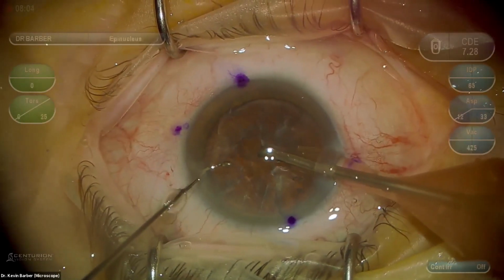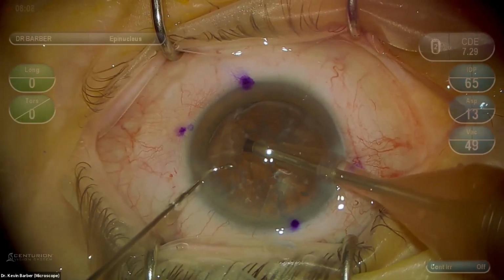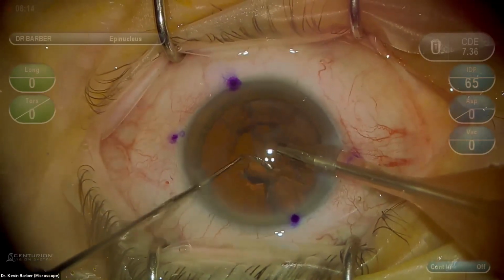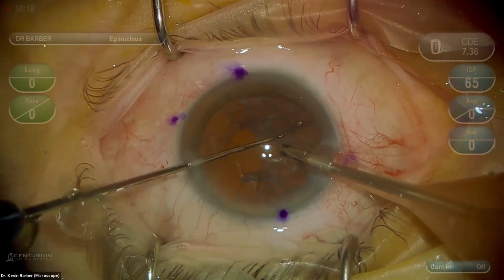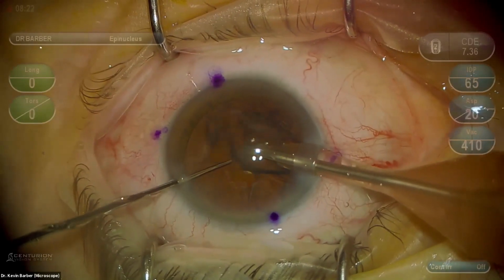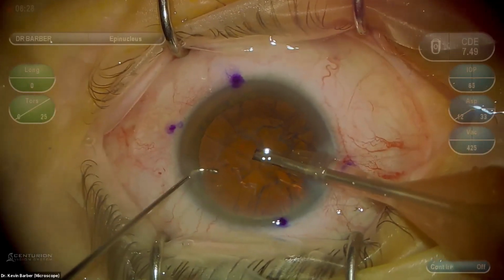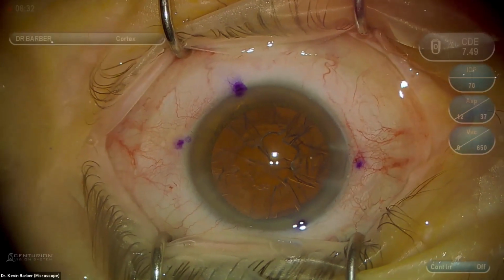Okay, so the nucleus is gone. I'm going to shift to my epinuclear setting. I'm not real aggressive trying to remove epinucleus with my phaco needle, meaning I'm not going to go out into the periphery to try to get all of the epinucleus with my phaco. You can take the epinucleus out with your I/A. I don't want to put my capsule at risk, but if the epinucleus will come like it just did, I'll take it. Cortex.